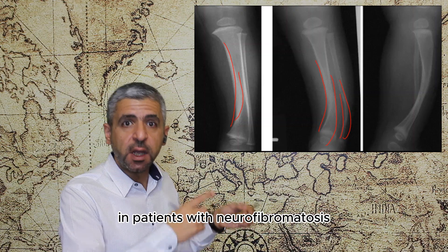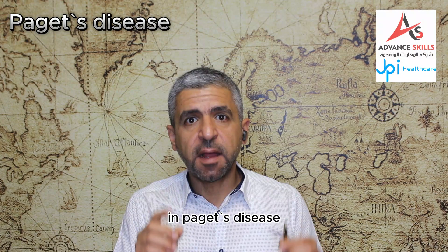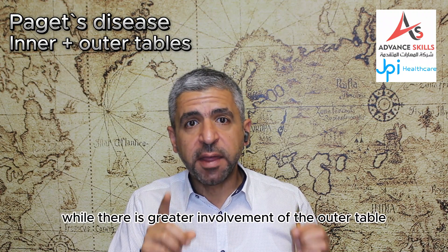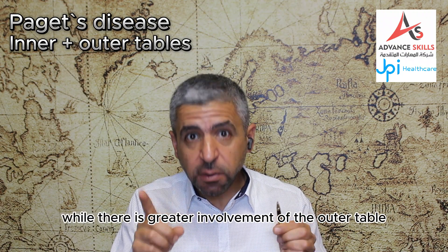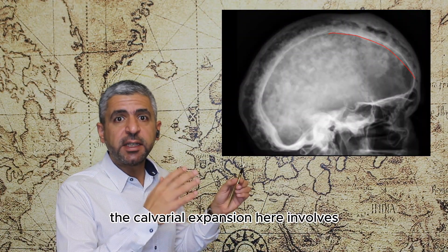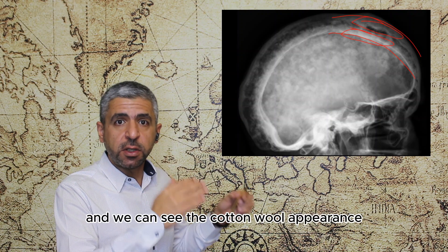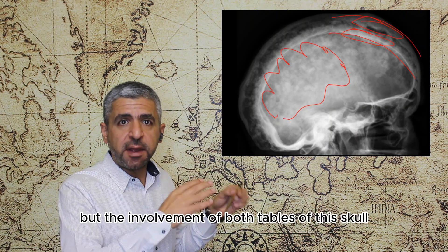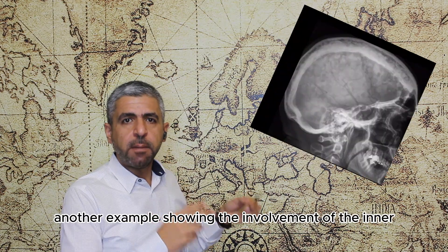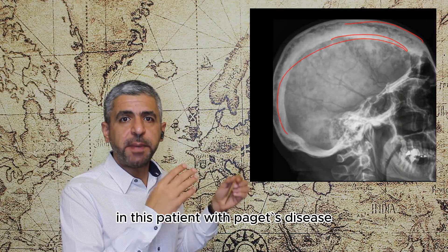Examples of bowing with cortical thickening in neurofibromatosis show preservation of the medullary cavity in all cases. In Paget's disease, calvarial expansion involves both inner and outer tables of the skull, while fibrous dysplasia shows greater involvement of the outer table only. Cases of Paget's disease show cotton wool appearance involving both tables of the skull, distinguishing it from fibrous dysplasia.